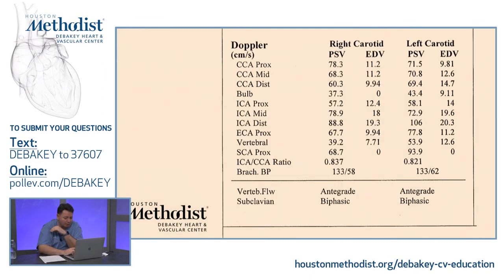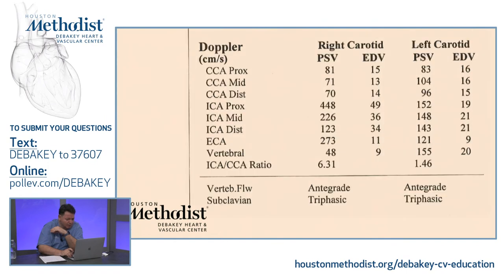Here's my next table. Another important part of our protocol is that we do bilateral blood pressure. So those bilateral blood pressures are also part of our table and part of our review. I do not see any increased velocity on this side. I do not see any increased velocity on that side. So this must be one of my beautiful normal ones.